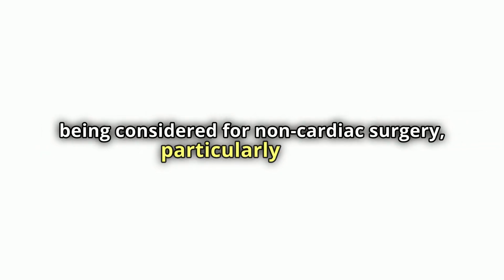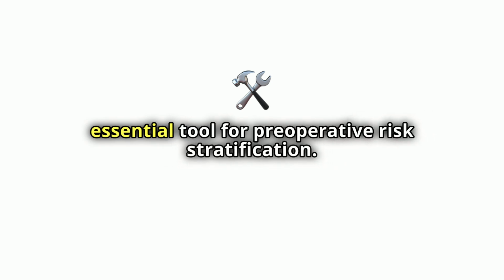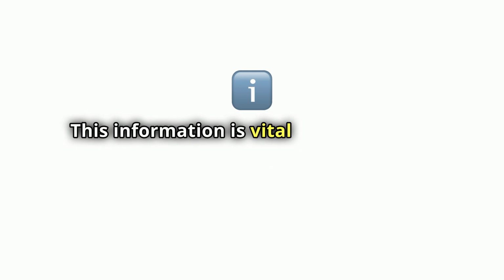For patients with significant aortic stenosis who are being considered for non-cardiac surgery, particularly those with reduced ejection fraction, DSE can be an essential tool for preoperative risk stratification. By assessing the severity of aortic stenosis and the presence of contractile reserve under stress conditions, DSE helps determine the patient's surgical risk. This information is vital for guiding the decision-making process regarding the timing of aortic valve intervention relative to non-cardiac surgery.